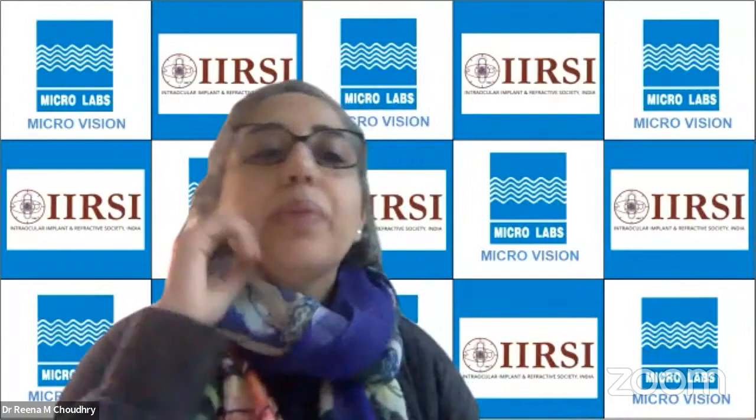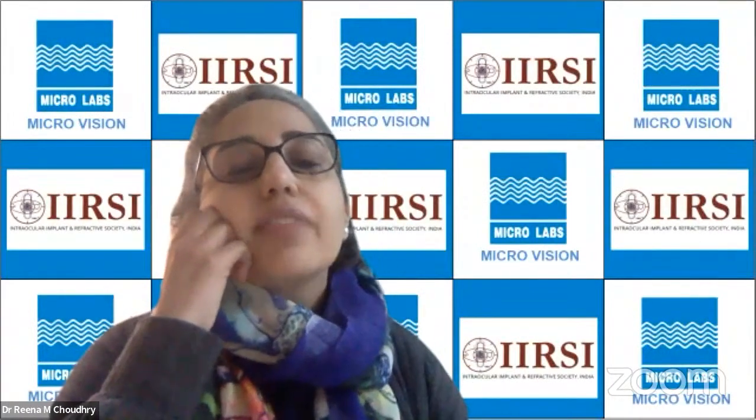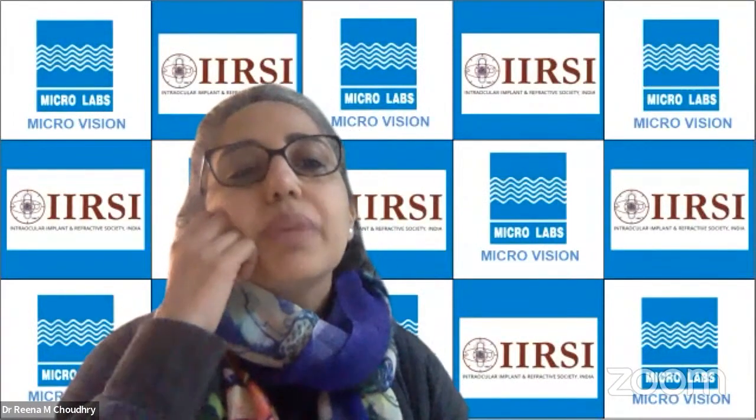And of course, do it with caution and take all the precautions so that you don't get a sudden leak or sudden shallowing of the chamber and so on. So don't do it too early. At the same time, don't wait too late also. I like the 2 week period. Usually, if I have to release the releasables, I choose a period after 2 weeks.